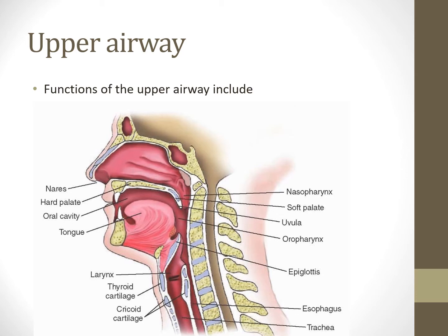Because when we look at something like the King tube down here, and that's why I named the presentation the way I did, the King tube purposely gets inserted into the esophageal opening. And when you look at something like a double lumen ET tube, that's going to be purposely put into the trachea. In fact, it goes deeper into the trachea, and one side will go into one of the main stems and the other one won't.